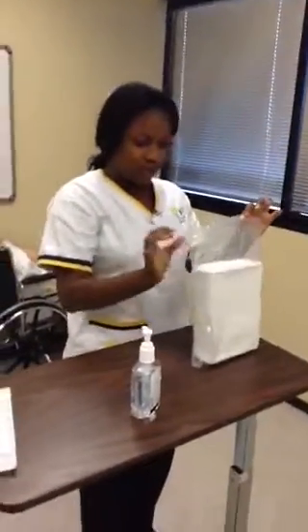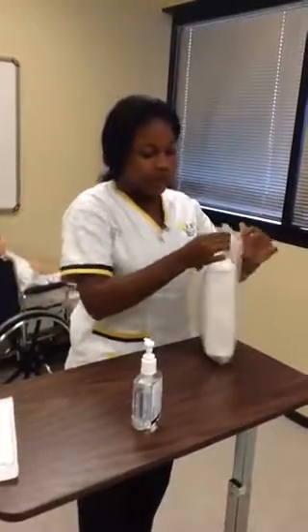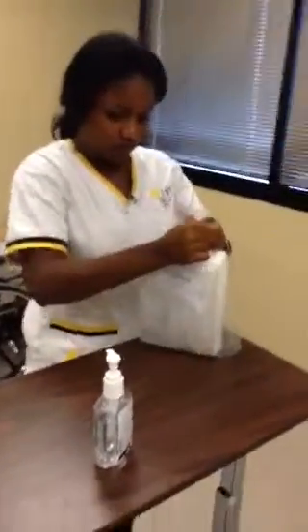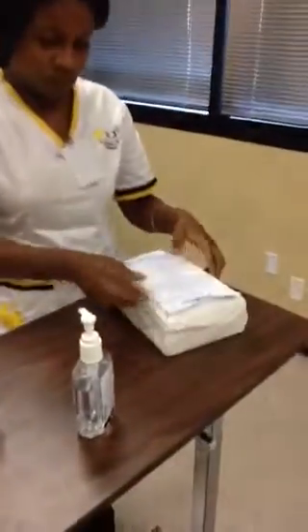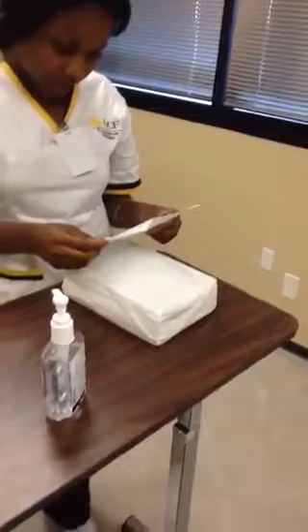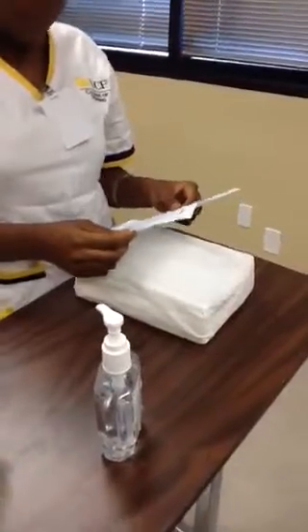Now I'm going to make sure that the surface is clean and dry, and then make sure that the package is not open. Now I'm going to open the package. Okay, make sure that the package is a 14 French catheter, that it's not expired, and that it doesn't have anything that the patient is allergic to, which is latex, penicillin, betadine.